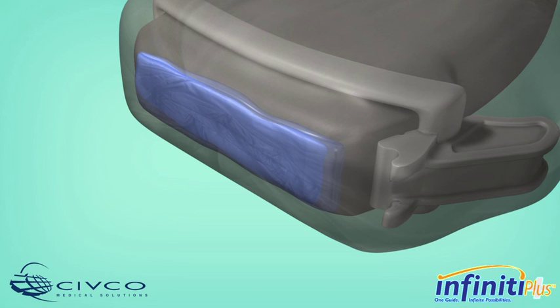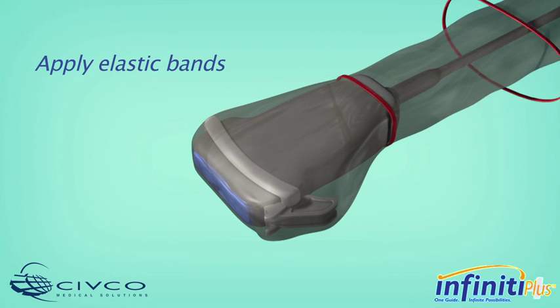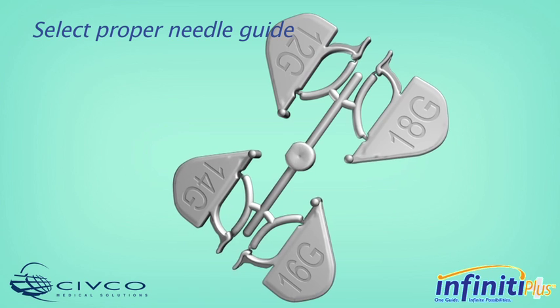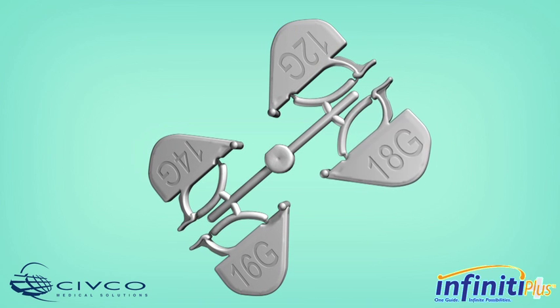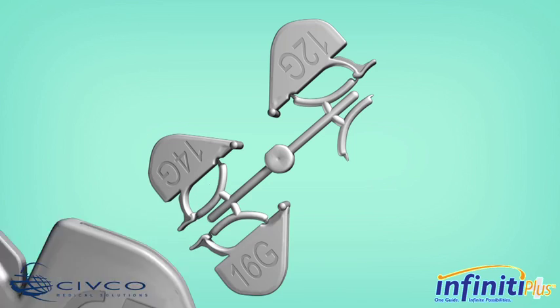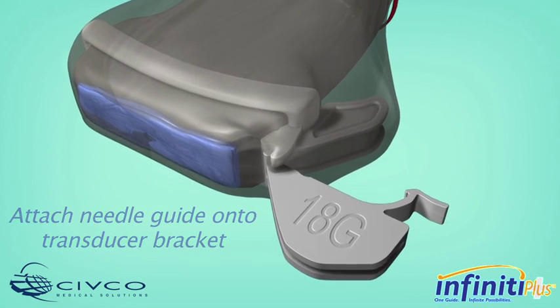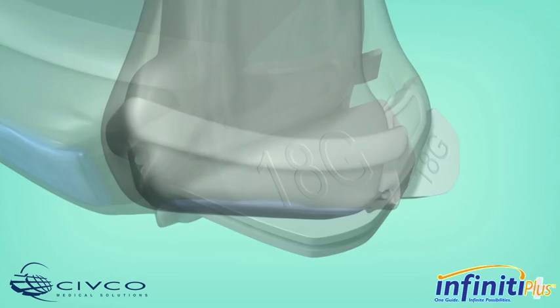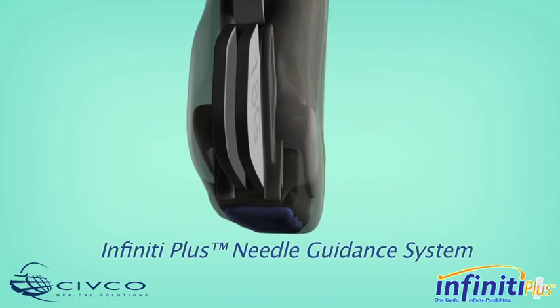Carefully remove any air bubbles that appear between the transducer face and the cover. Apply the enclosed sterile elastic bands to secure the cover in place. Based on the size of instrument being used for the procedure, select the appropriate needle guide gauge size attachment to access the targeted anatomy. Attach the Infinity Plus Needle Guide onto the transducer bracket and snap it in place with a single click. Once the needle guide is secured to the bracket, the Infinity Plus Needle Guidance System is ready for use.